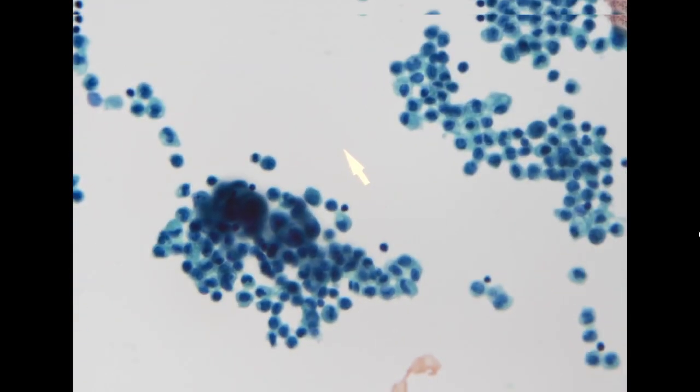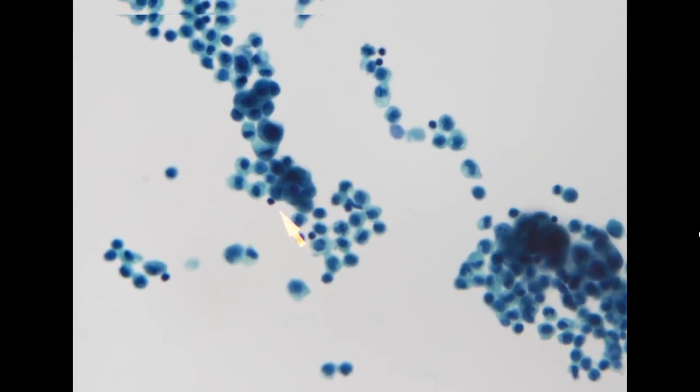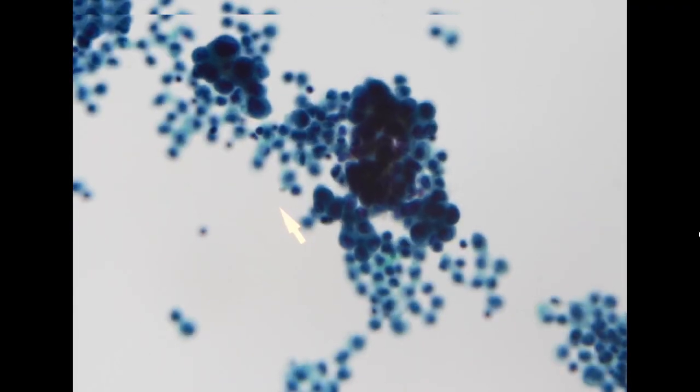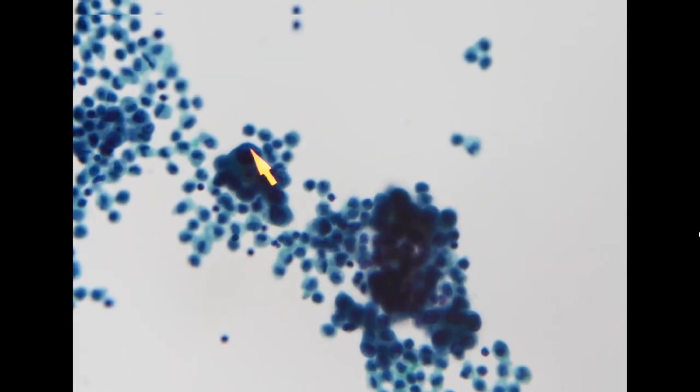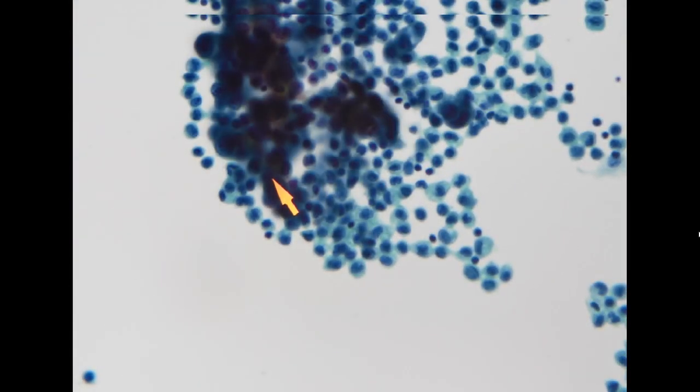And then we start to notice some clusters of cells with three-dimensional architecture and a much bigger nucleus compared to the adjacent normal cells. It's also a little bit darker, but it's kind of difficult to tell because everything seems to be very dark.